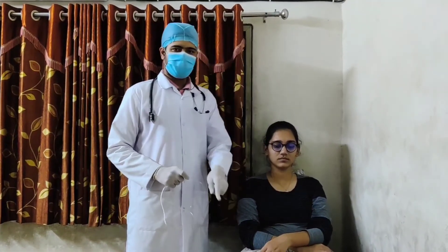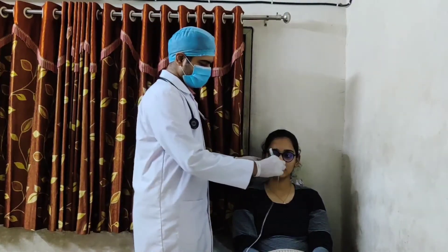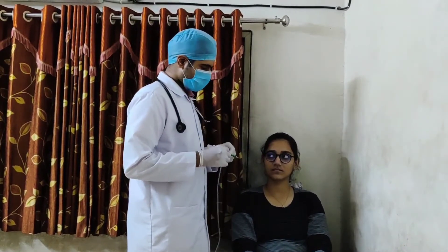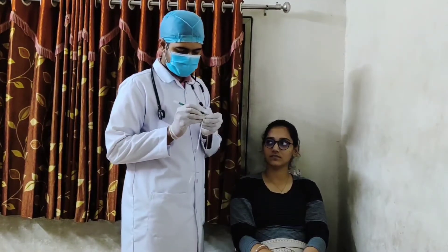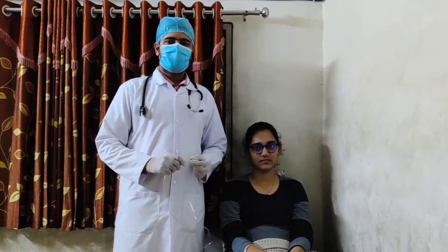For inserting the nasogastric tube, the patient should be in a high-Fowler's position. Prior to insertion, we should first measure the distance from the nose to the earlobe and mark it on the tube, and then from the earlobe to the xiphoid process and mark that as well.